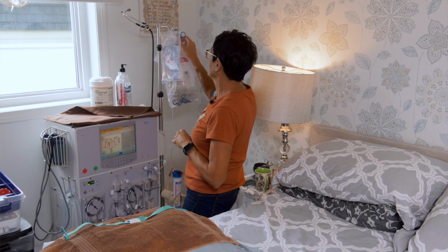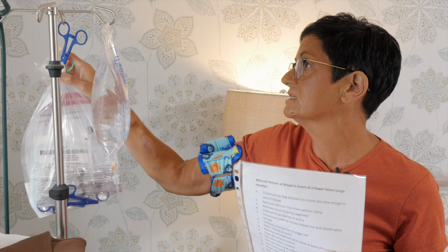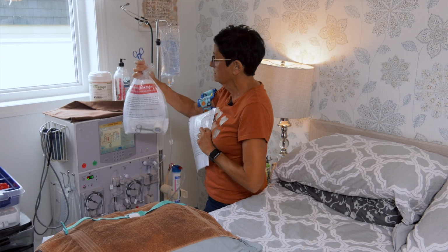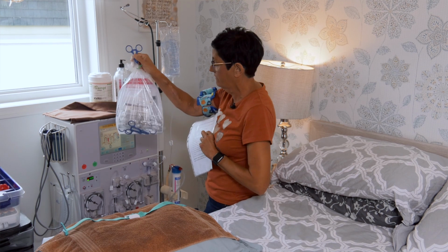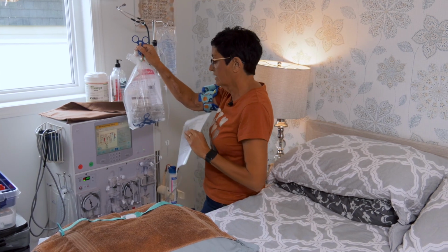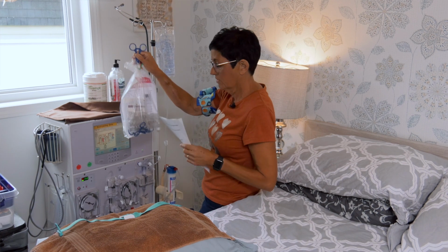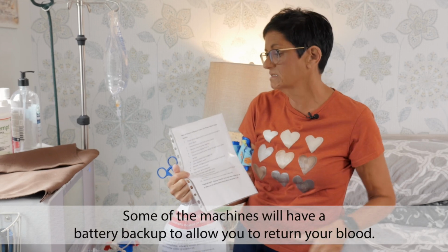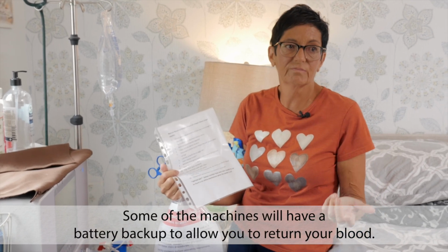I should mention that you always have this hanging on your dialysis machine. It's an emergency disconnect. Say your house catches on fire, you've got everything in here you need, you just cut your lines, you clamp, cut, and go. But then also there's this, if the power goes out, step by step how you return your blood.